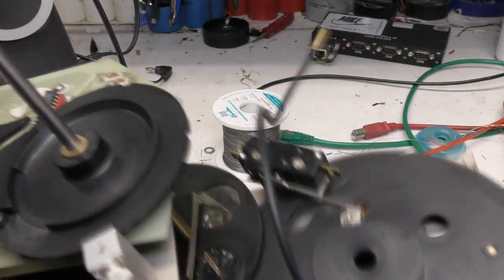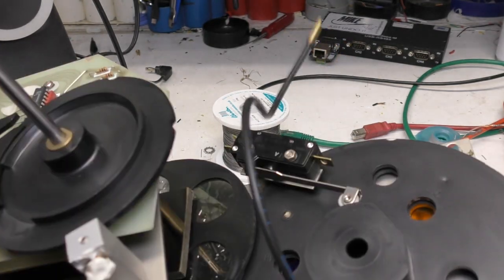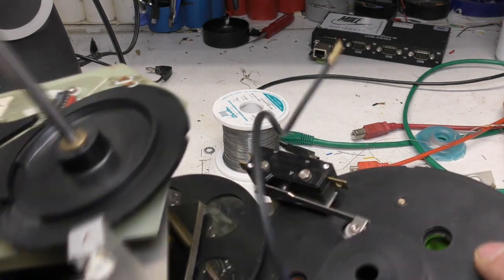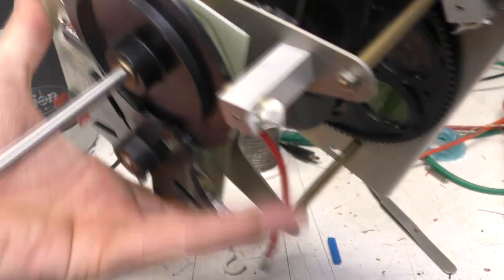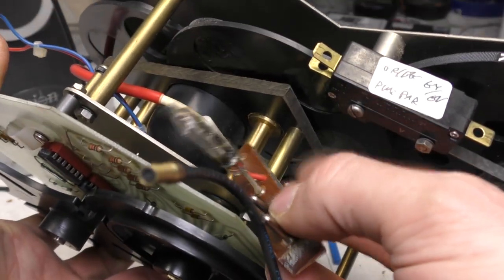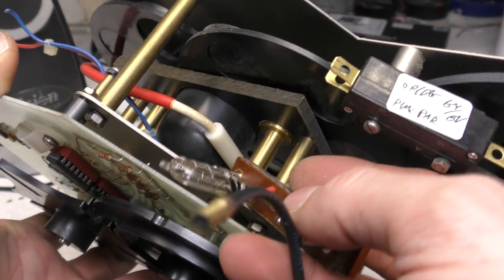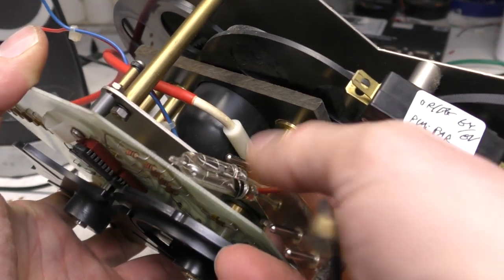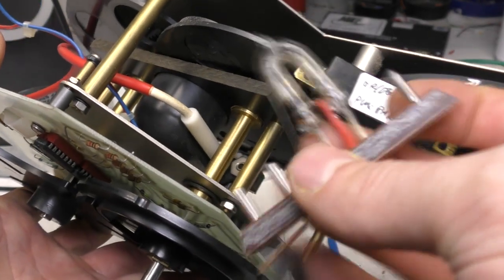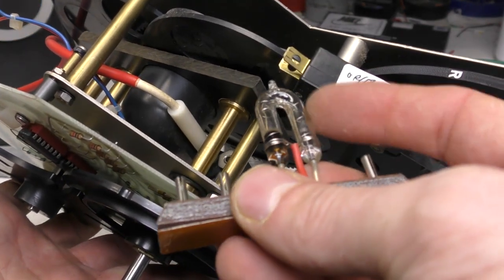And so there's this micro switch that operates when the blue filter's present, so I haven't quite figured out what that actually operates. And one bit of really poor design on here, the flash tube. These flash tubes, the way they work is you've got a capacitor which is charged up to around 300 to 400 volts, and then there's a high voltage trigger impulse that actually triggers it, and this has actually got wire wrapped around it.